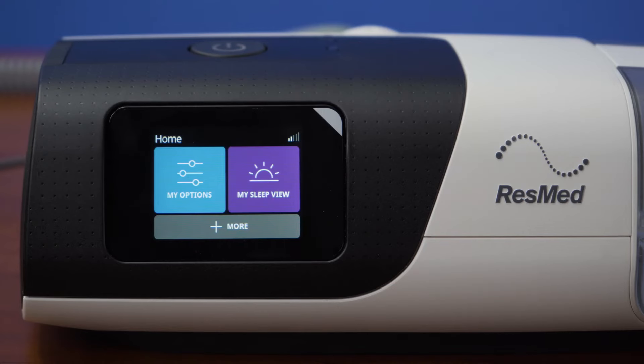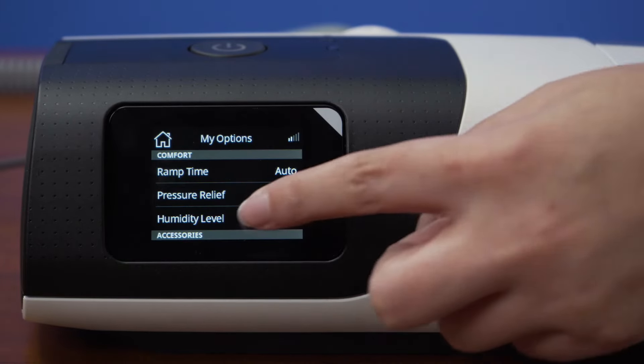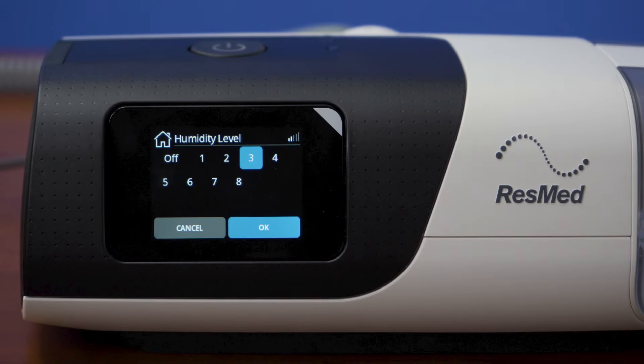Now that we've gone through the initial setup process for your PAP device, we can begin to learn more about the usage and settings. To adjust your humidifier settings, turn on the device and press the home icon on the screen. Tap on the my options tab, then on humidity level. Your options are off or levels one through eight, with one being the lowest and eight the highest. If you do not have water in the chamber, then the humidifier should be set to off.